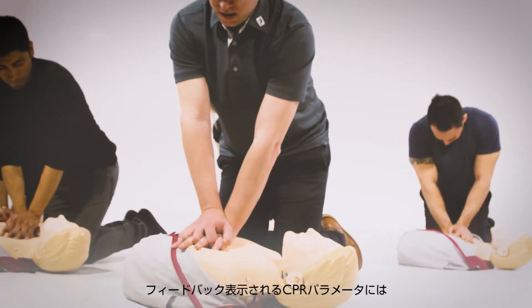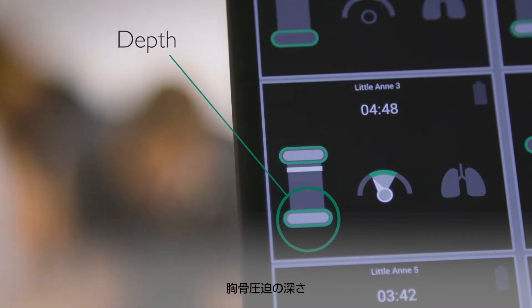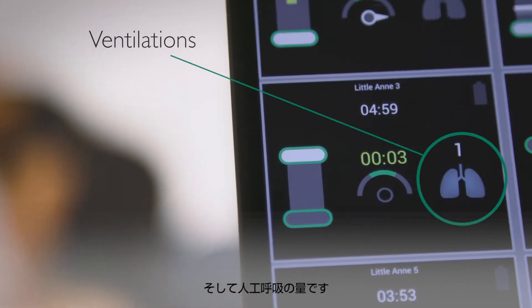CPR feedback parameters include compression rate, compression depth, compression release, and ventilation volume.